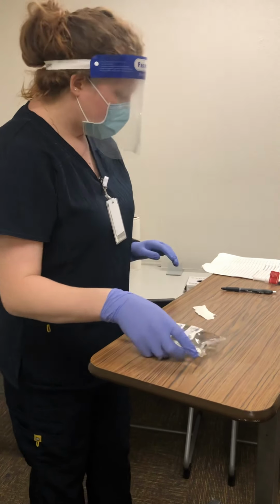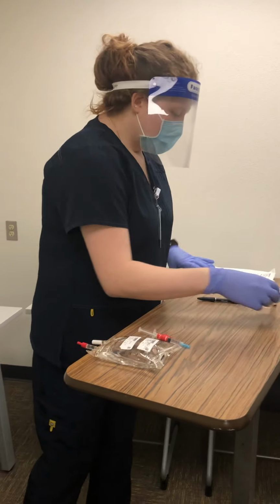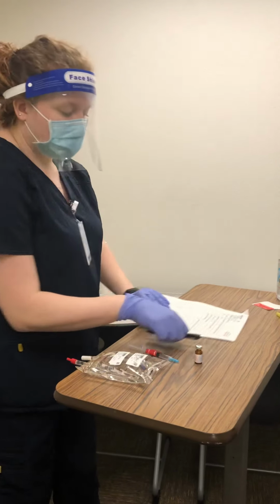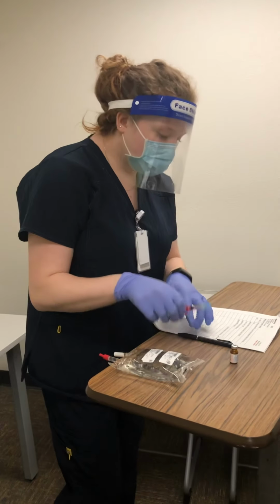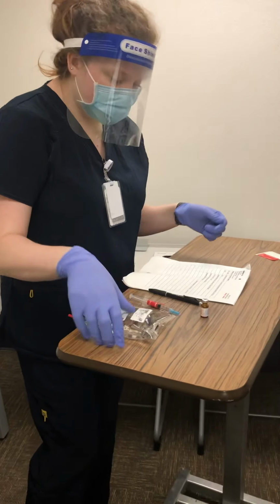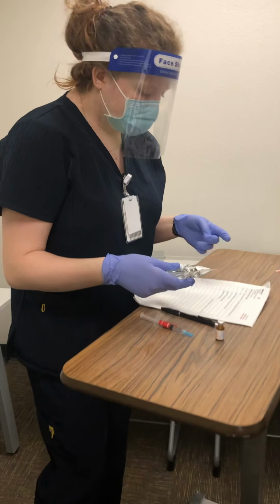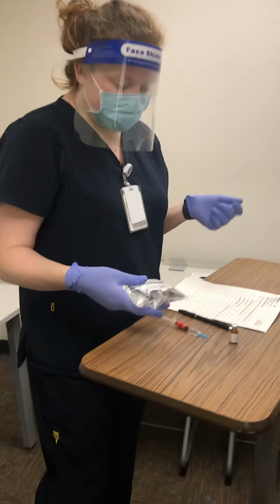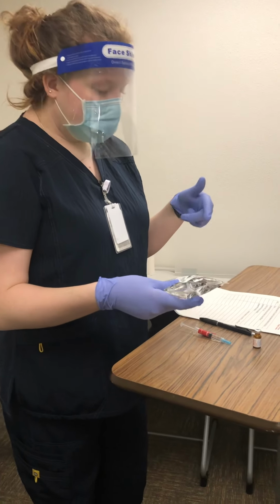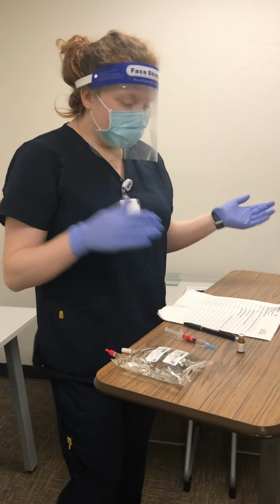There we go. All right. So before I leave the room, this goes with me, and I'm doing my second medication check. So I'm verifying my 6 rights for my morphine, and everything checks out. I'm verifying it for the potassium, that checks out, and I'm also verifying my 6 rights for my normal saline. Checks out. I've already checked that potassium chloride and normal saline are compatible with each other. So I'm ready to take this all to the patient's room.